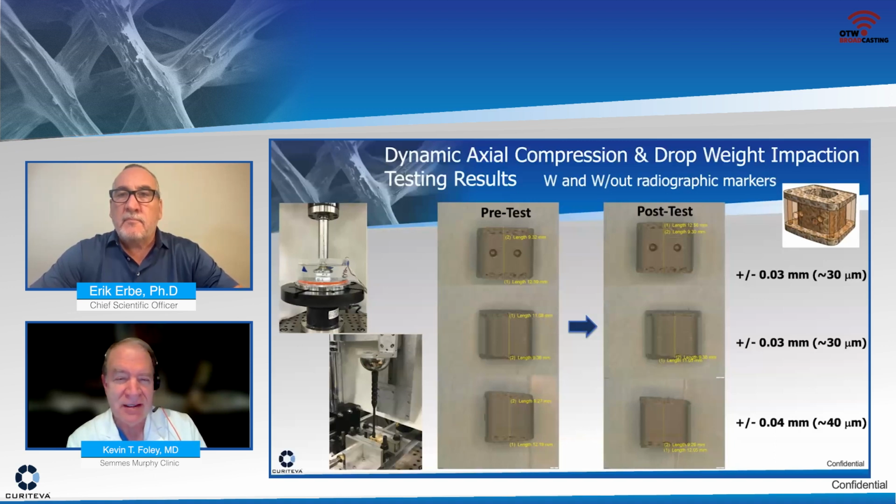I think part of that is the fact that all of these pores are interconnected, Eric. If I take a solid material and I just produce porosity on one surface or another surface, theoretically, I've weakened that surface, right? If instead I produce pores by this interconnected trellis, right? All of these interconnections acting together to resist the load, I've got a naturally stronger structure. That's why bone is like it is.